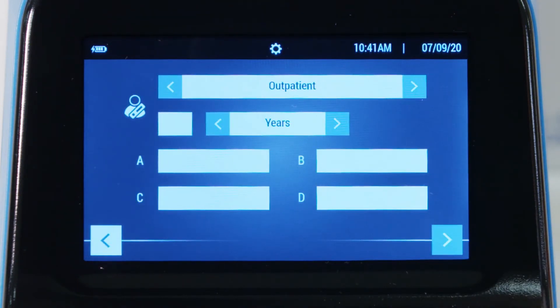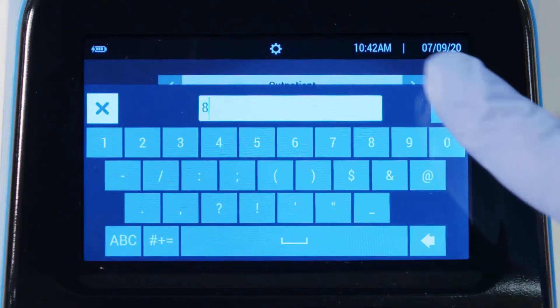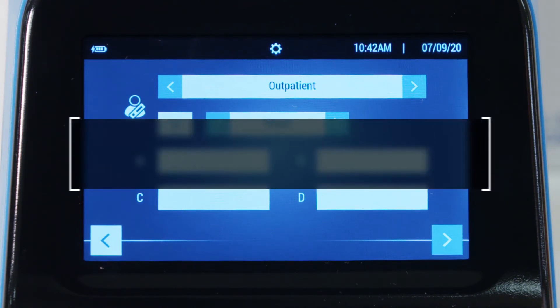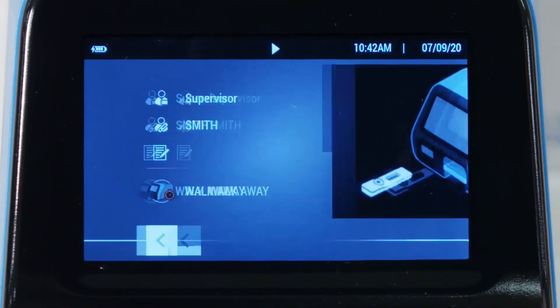When SOFIA2 is configured with Verena, the user will advance to a screen to provide additional patient information. If the user has configured SOFIA2 to require patient age, enter that information in the appropriate field. Users can also choose to label the patient type. The default patient type is set to outpatient and is the most common selection. All data in these fields is optional unless otherwise selected at setup. Press the forward button in the lower right corner.